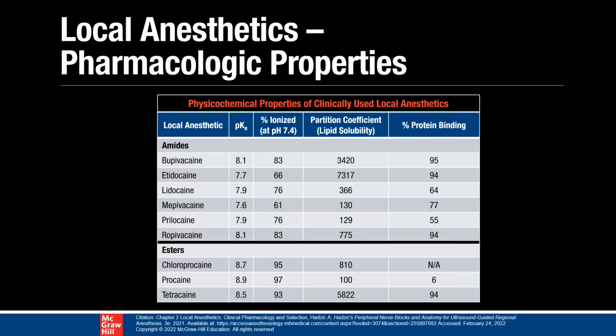Both of these factors contribute to why they're ideal for hip blocks. These patients are sitting around in pain for hours, potentially waiting on surgical fixation, and we need to have a long-acting, highly potent local anesthetic on board to adequately anesthetize the nociceptive fibers and the peripheral nerves that innervate the hip capsule.